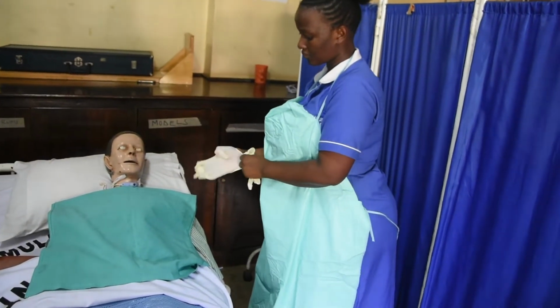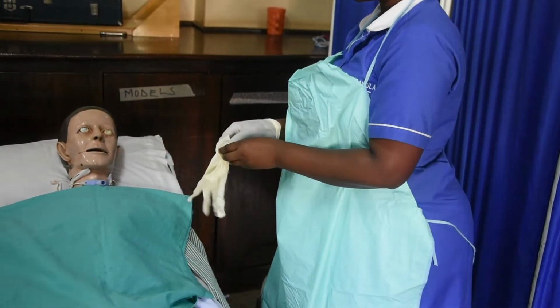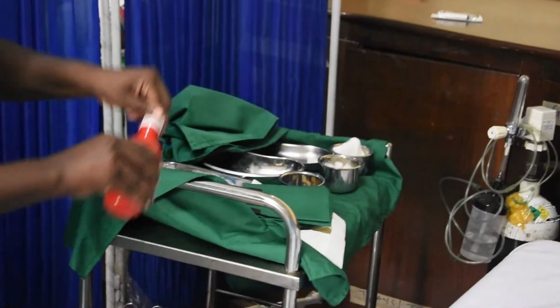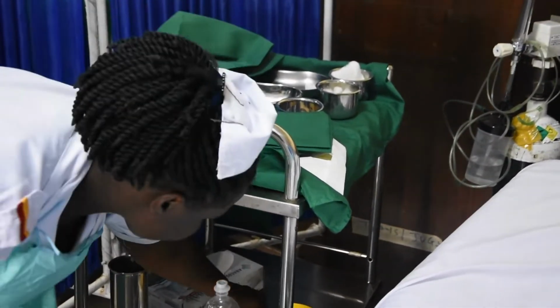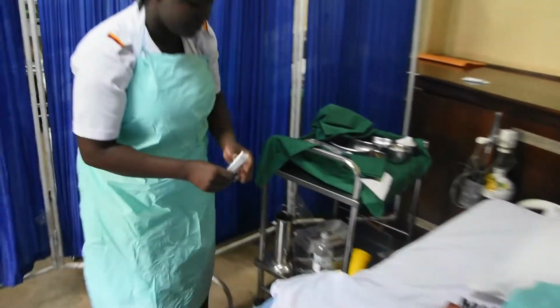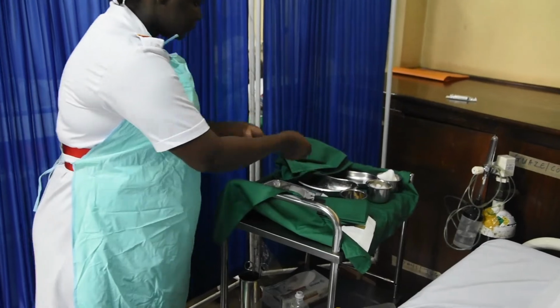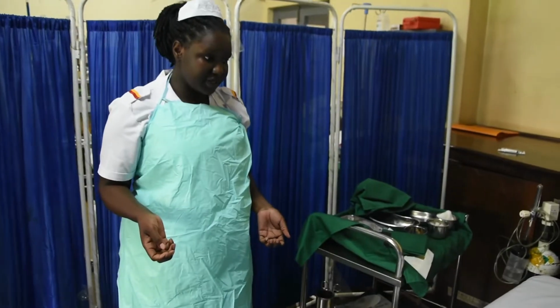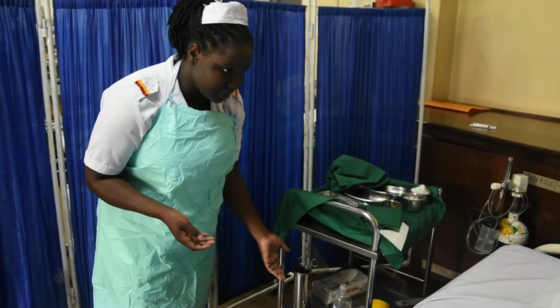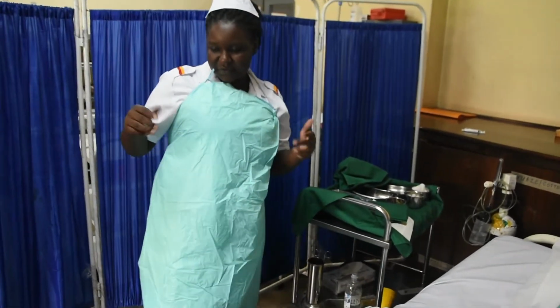Then I make sure everything is prepared. This is hydrogen peroxide, where we shall immerse the used tracheostomy tube, which is already in situ. We have to open our syringes, ready for use. So in case there is need to do oral care, that's where our tray will be of use. As of now, our patient doesn't need oral care. So I have to rewash my hands.